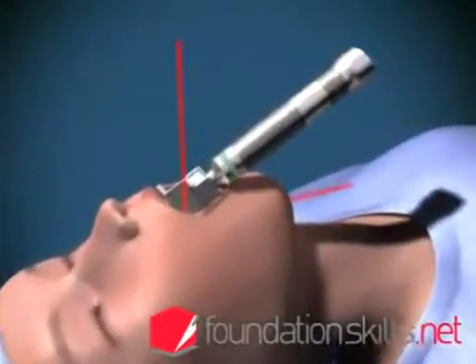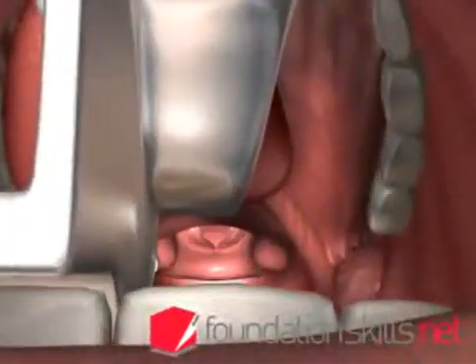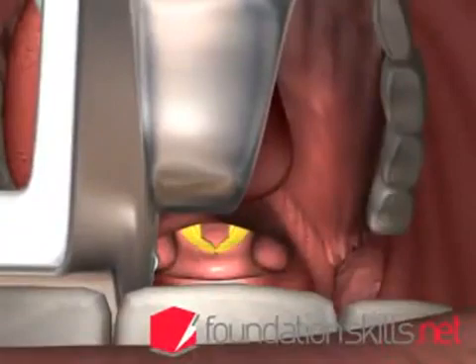With the handle of the laryngoscope pointing away from you at 45 degrees, lift upwards and away to lift up the tongue and epiglottis to display the vocal cords and the laryngeal opening.